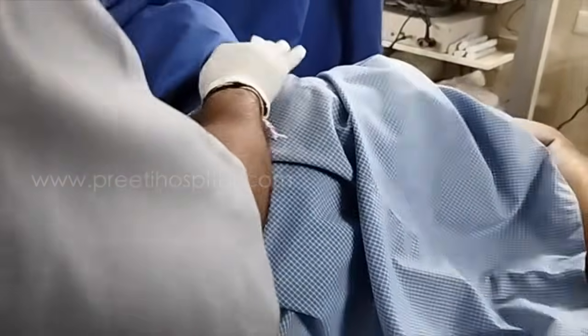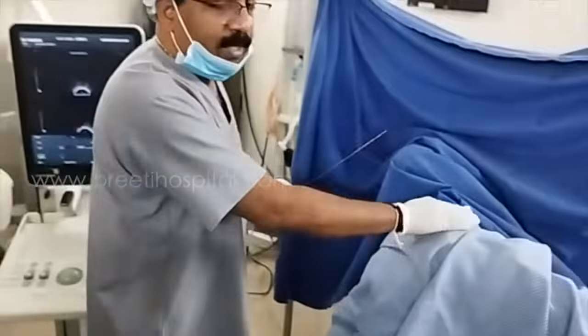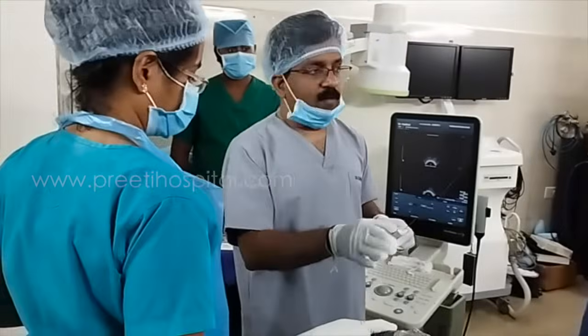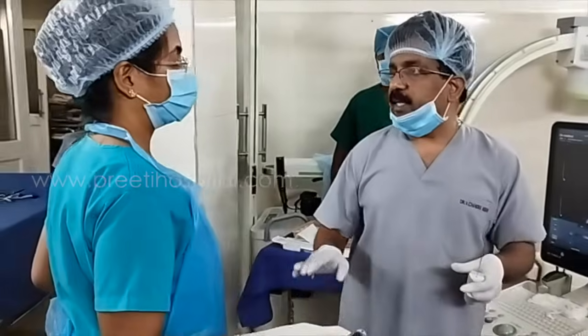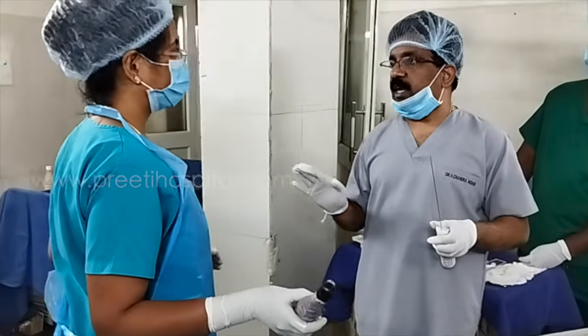Thank you. Cooperated. It is over. Don't worry. Sleep for some time. We don't change the position for some time. We will sleep in the supine position. After half an hour, we have the IV antibiotic. We have the IV line also, and anesthetist monitoring and anesthetist supervision.